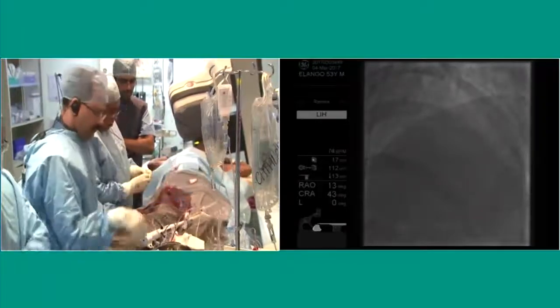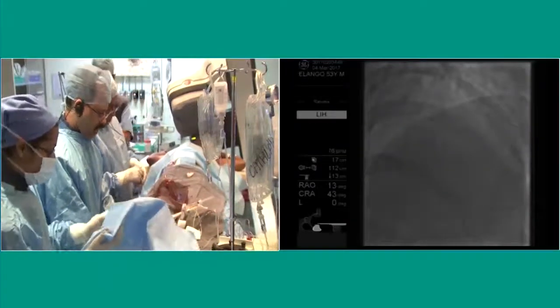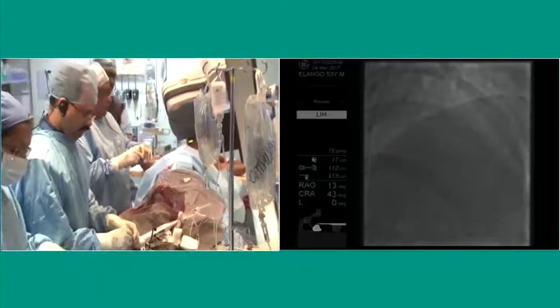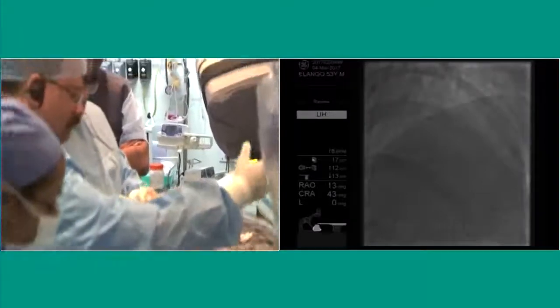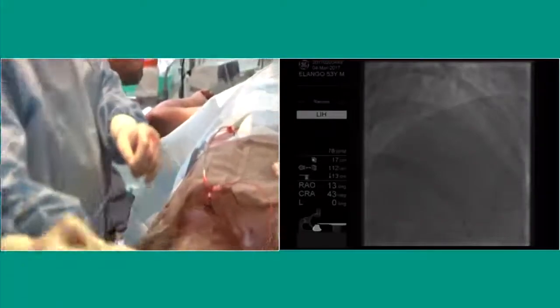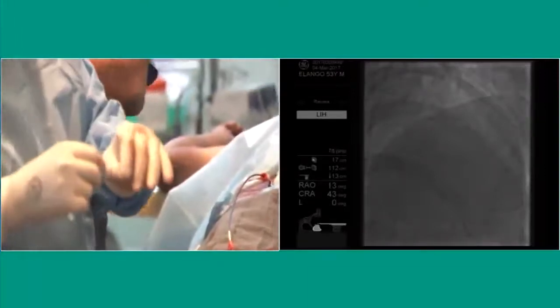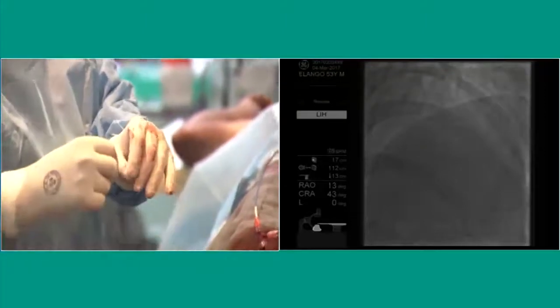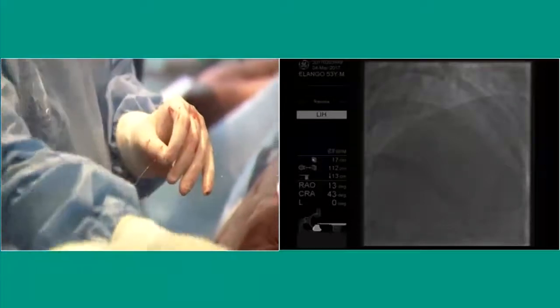It's interesting, we never found a need for the rotor glide, or whatever that creamy liquid was. We never had it available in the last 25 years of rotational atherectomy that we've done. Flush on. Can you believe it? Mathew, do you realize that we've been doing rotational atherectomy for 25 years? Yeah, it's amazing.